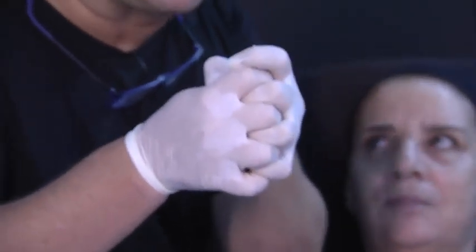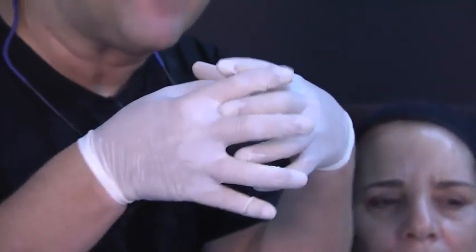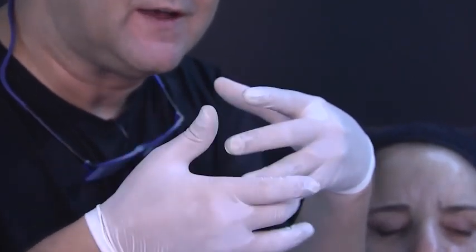Okay. Right. So I'm going to do my entry point again. Remember that NASHA Technology retains a little bit less water than OBT. And the reason why, if you see my hands, okay, and you see here, because of the mechanical cross-linking, there is less space to retain water in between my hands than if I have this configuration.